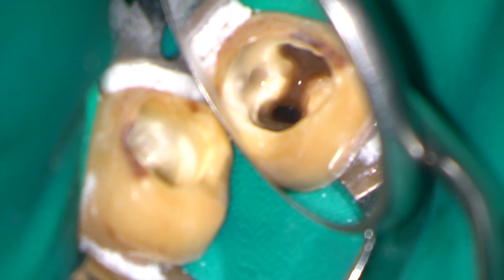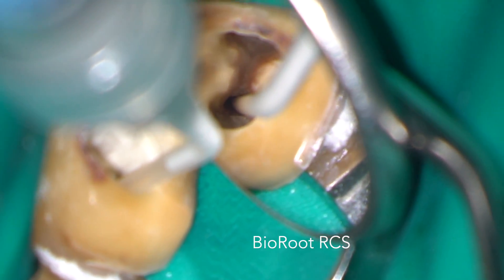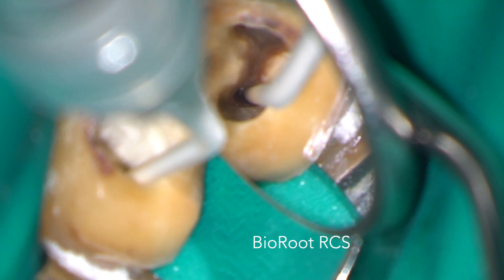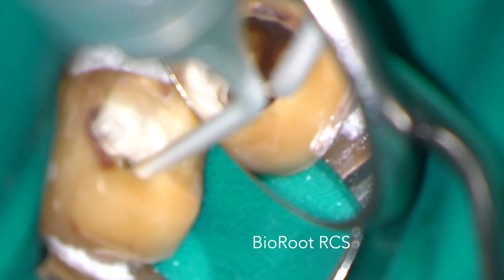After drying all the root canals with sterile paper points, I mixed the BioRoot RCS according to the manufacturer's instructions and then injected it into all the root canals. Into this, the primary cones were then inserted very slowly.